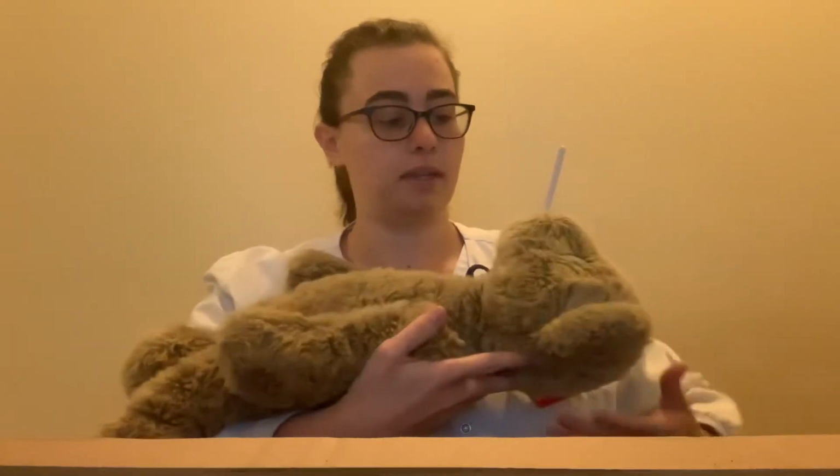Here I have my patient here. This patient cannot protect their airway, so they are intubated. This is going to be the ET tube. You're going to measure from the mouth to the stomach with the OG tube to ensure the length can reach the stomach. You are then going to insert the OG tube.